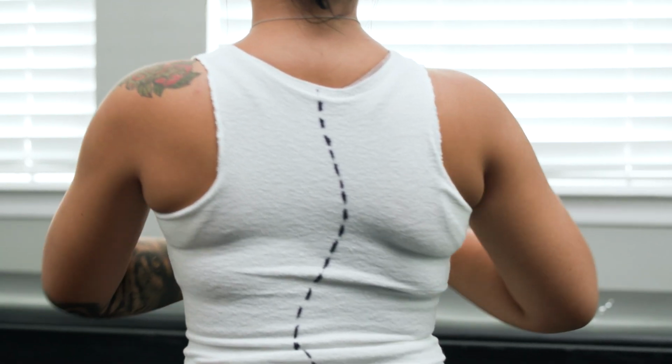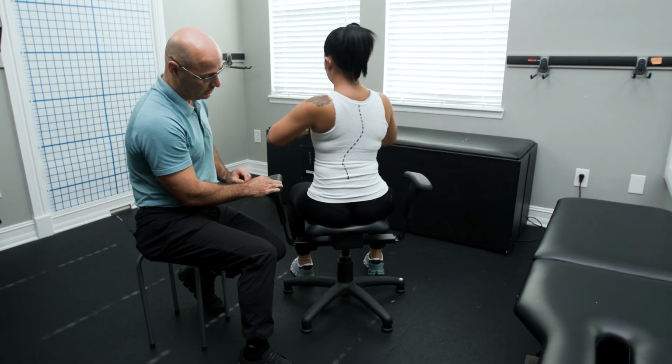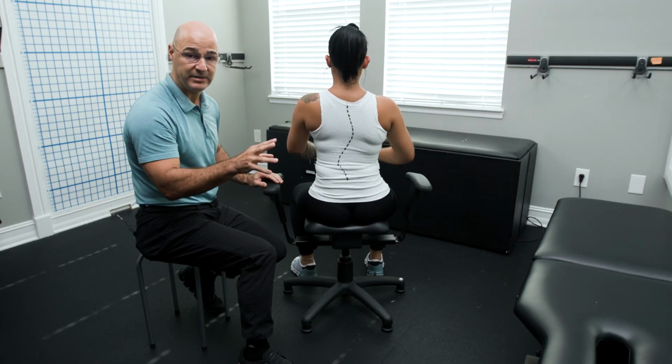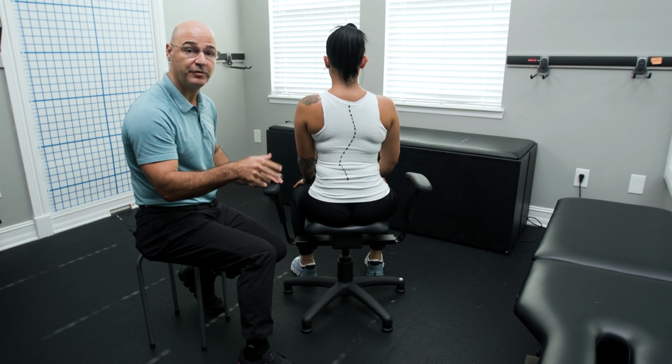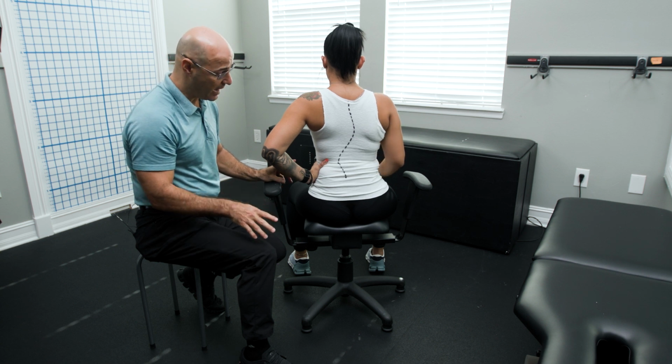And you can see as she turns that she can get through full rotation through the pelvis. Okay. And those are the 3 basic motions that we have. Now we have specific curve types that we do as well. So I want to demonstrate the S-curve pattern. The S-curve pattern is 2 movements.